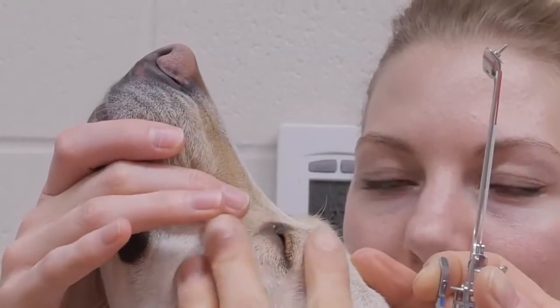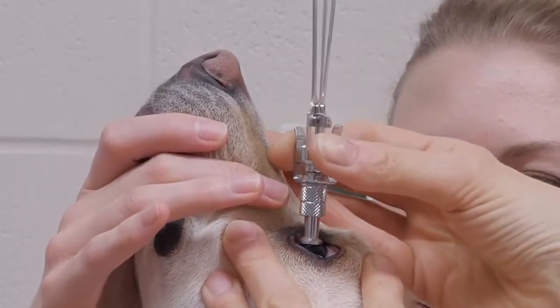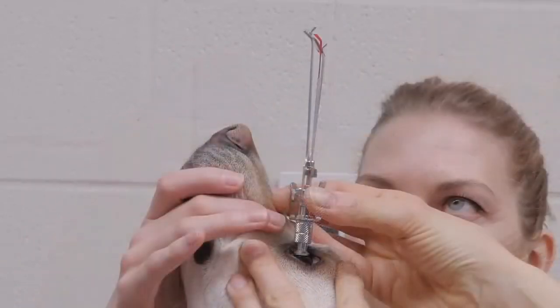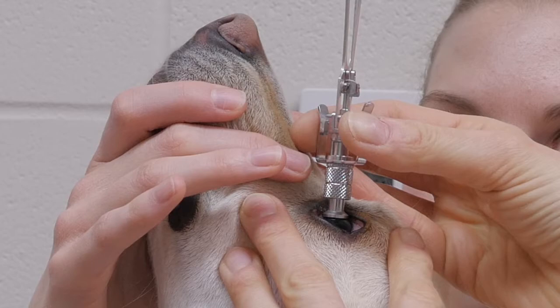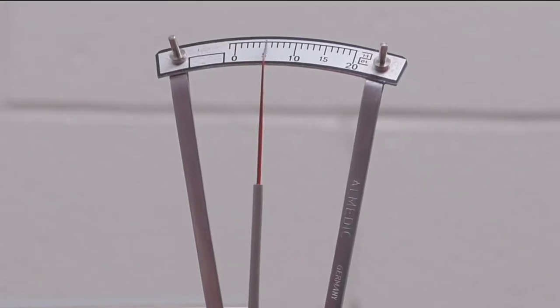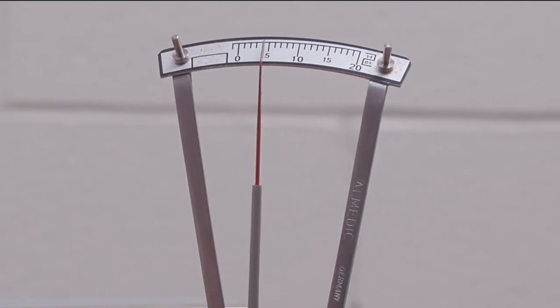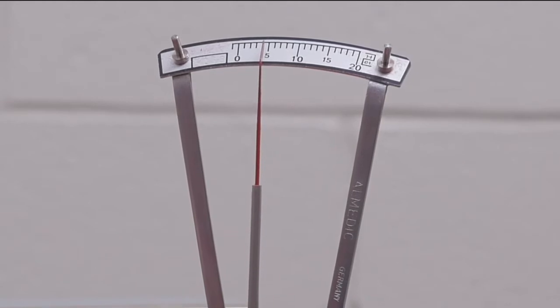Once the tonometer is placed on the cornea, the holding brackets are slid down to approximately the middle portion of the cannula. This allows the weight of the instrument alone to rest on the cornea and ensures that the examiner is neither pushing the tonometer onto the eye nor lifting it off. Initially, the examiner will note that the needle will move back and forth for the first 1 to 2 seconds, and then it will sit still. This is the point that the reading is taken and the tonometer is removed.